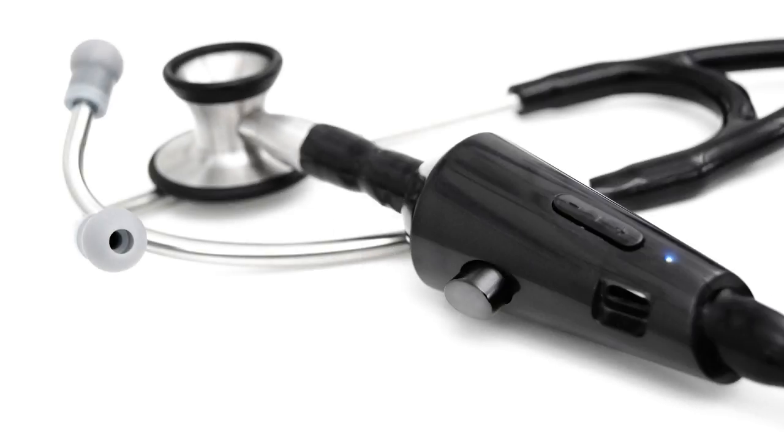This is Pat Solver with The Doctor Weighs In, and we have a really exciting story today. Actually, it's a bit of a scoop. I have with me today Conor Landgraf, who's the founder and CEO of Echo Devices, and he has an amazing stethoscope to tell us about. Welcome.